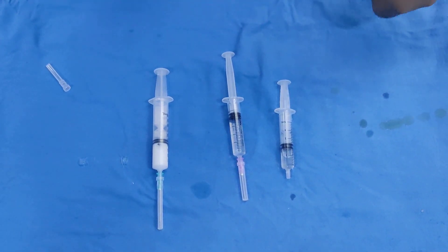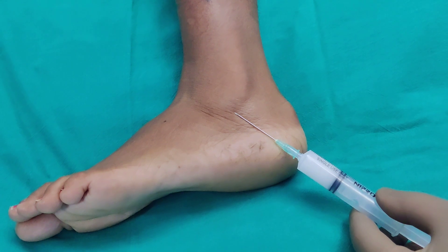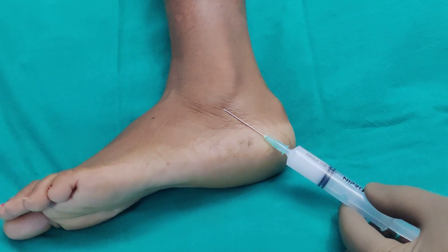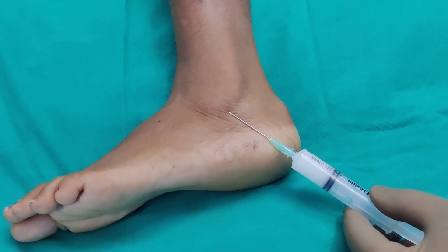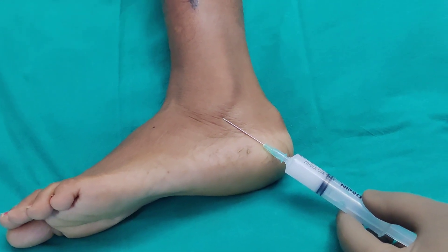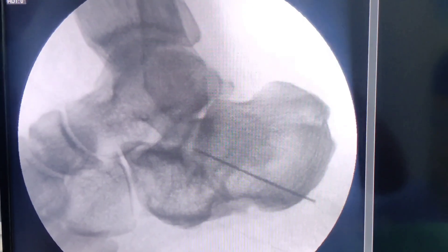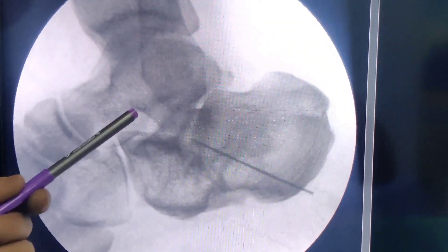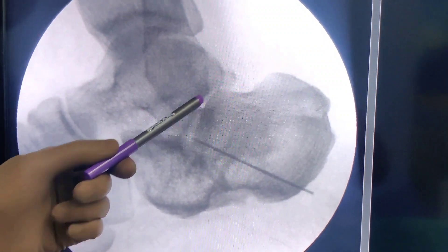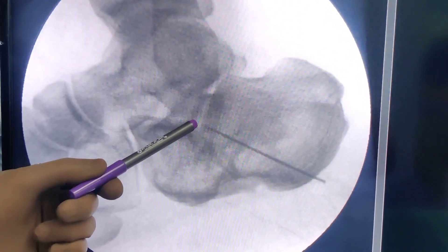The next step is to localize the subtalar joint using fluoroscopy. I use a needle to localize the subtalar joint or the sinus tarsi, and I will show you the fluoroscopic images to indicate where you should be and what the right spot is. Looking at this X-ray, this patient has a heel calcaneal fracture — this is the posterior facet of the calcaneum, and this is where you draw the angle of Gissane. That is the spot I aim for.